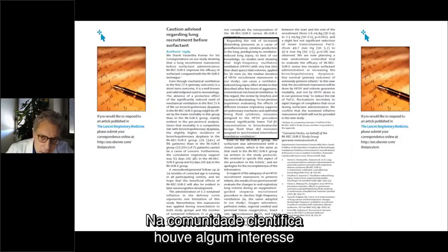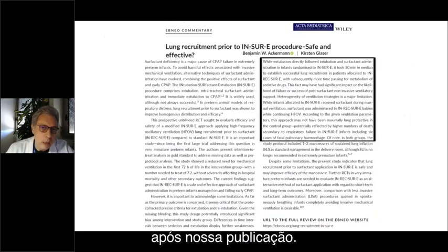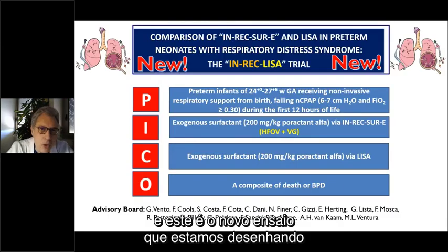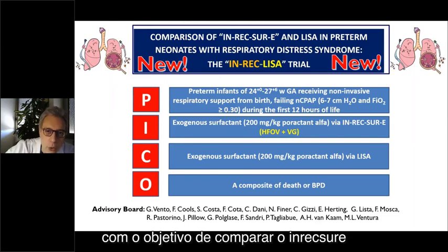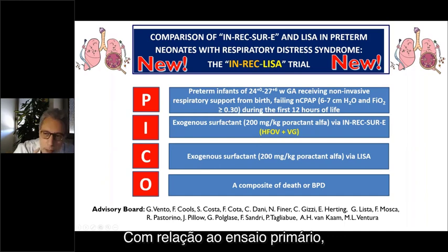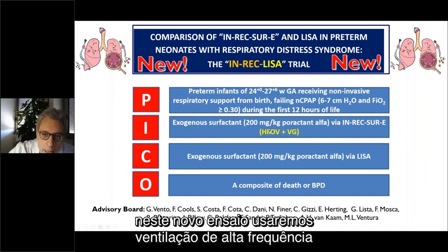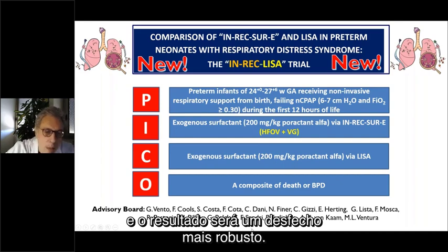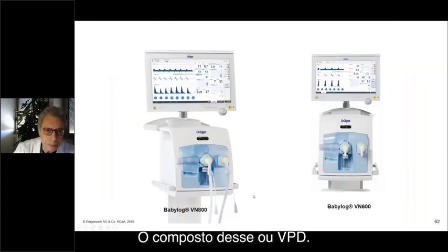outcomes. In the scientific community, there was some interest after our publication. There were some letters to the editor, our reply, and this is the new trial we are designing, aiming to compare the HFO with the less invasive surfactant administration with respect to the primary trial. In this new trial, we will use high frequency ventilation plus volume guarantee during the recruitment maneuver, and the outcome will be a more robust outcome, the composite of death or BPD.